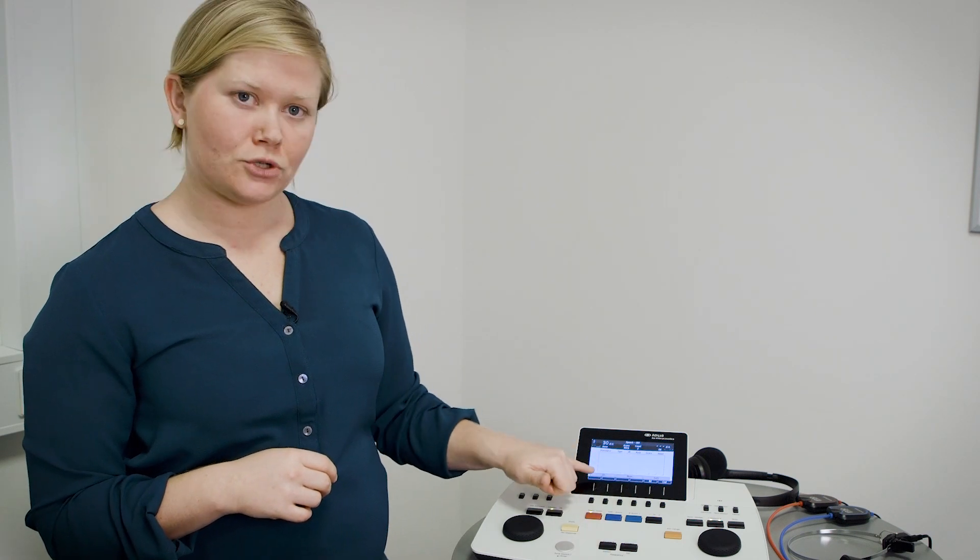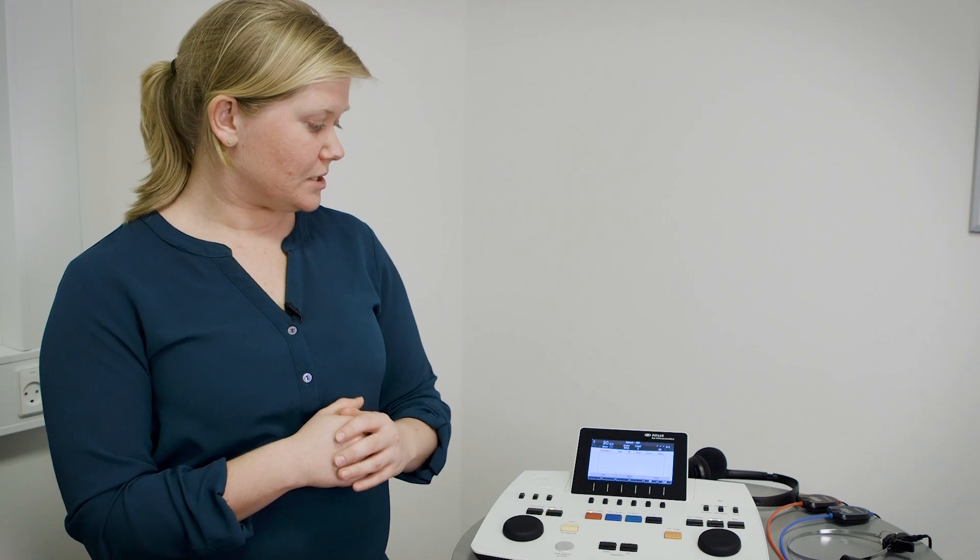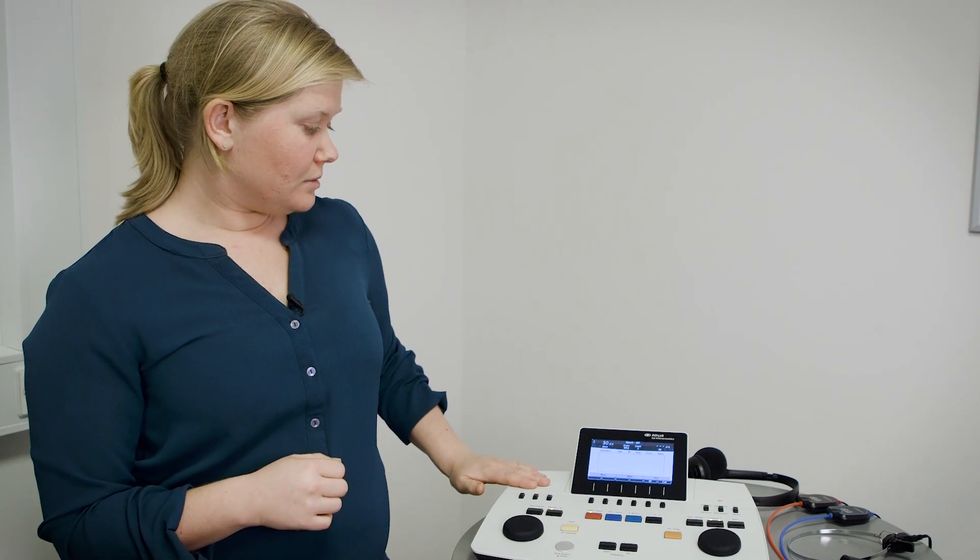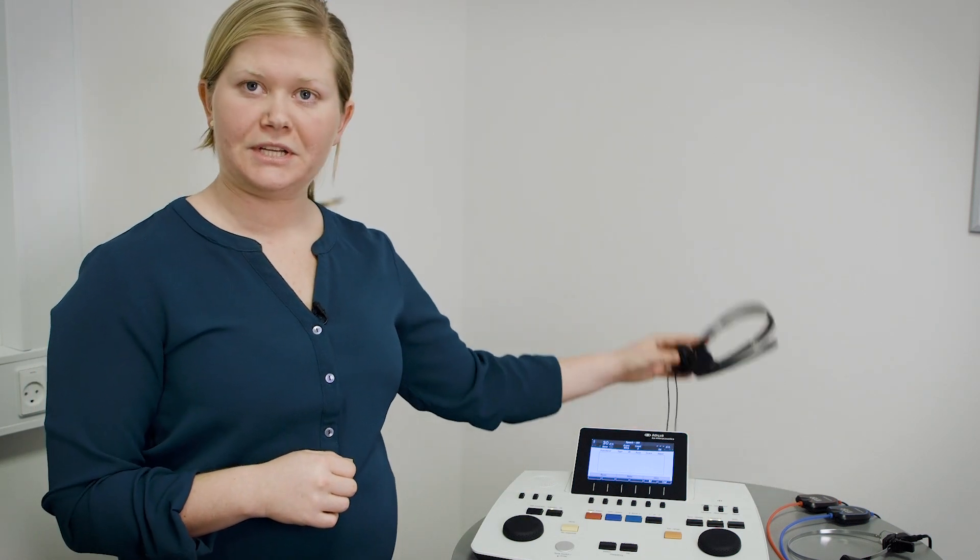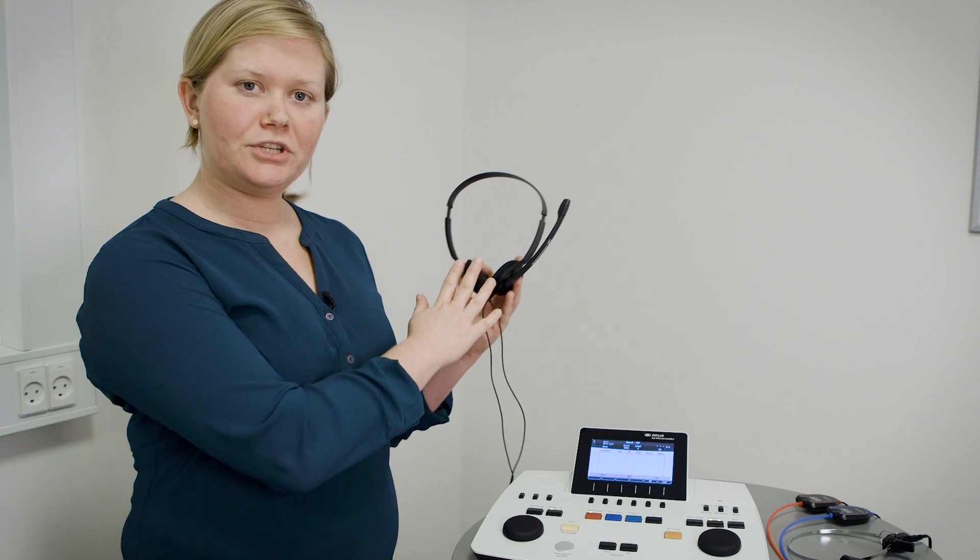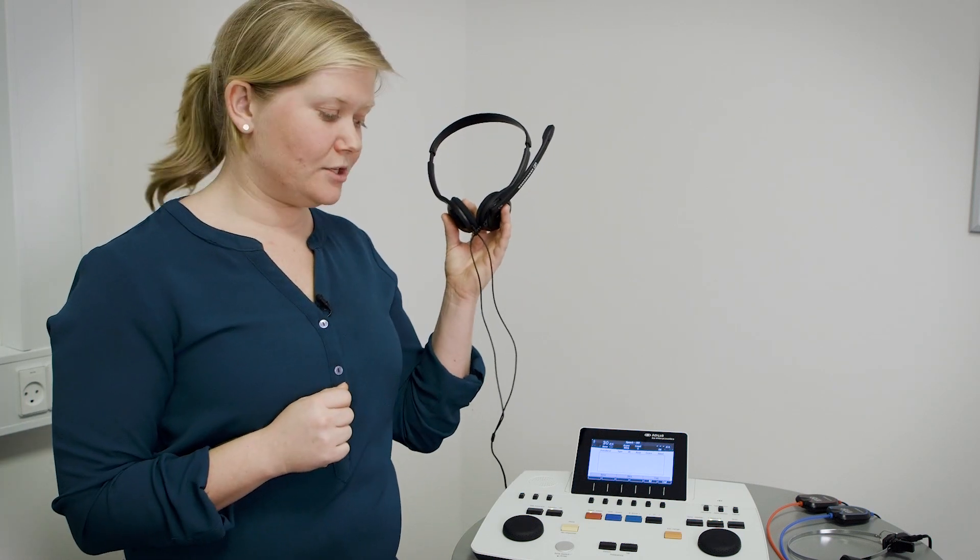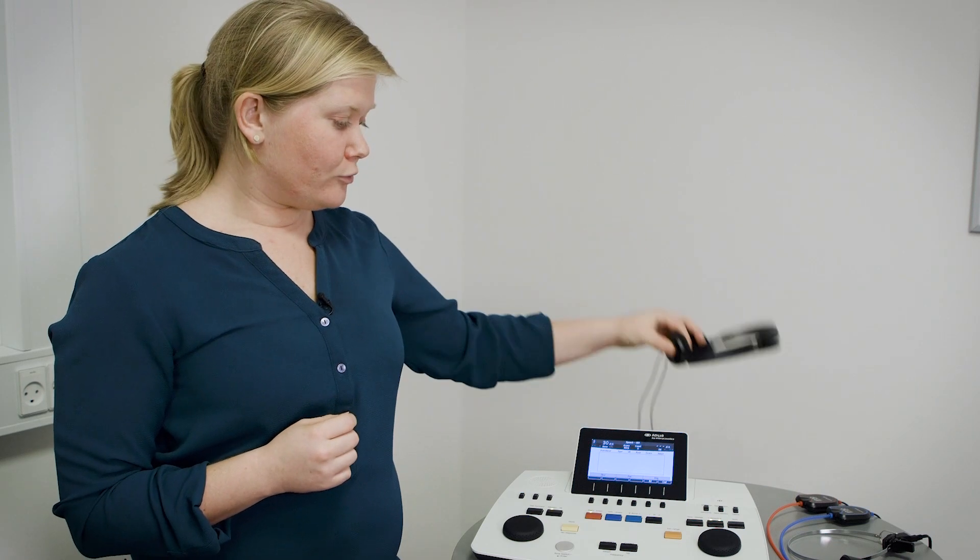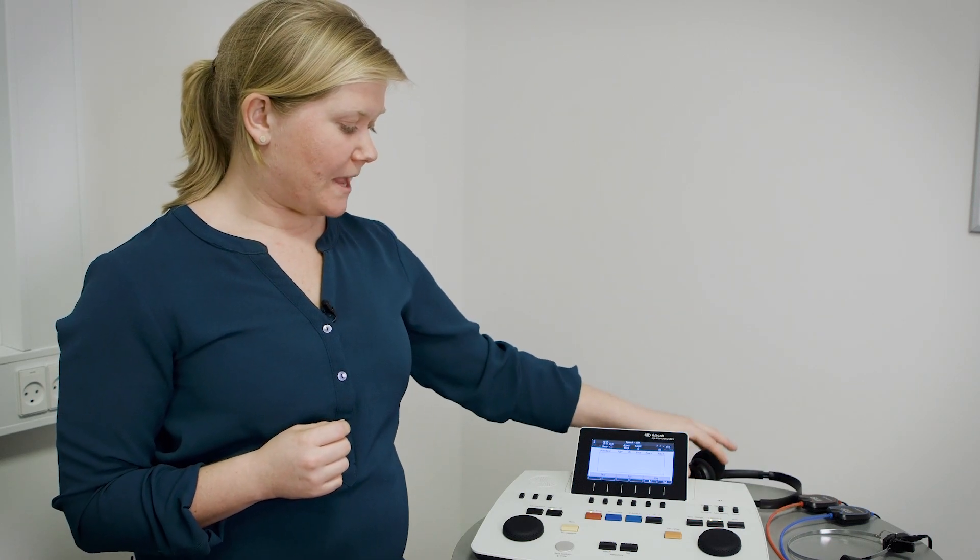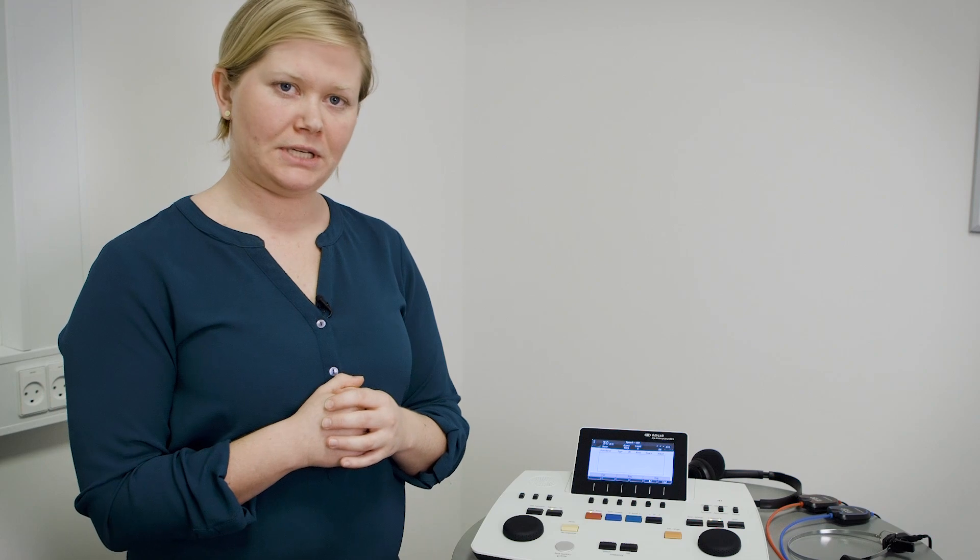We can see the words that are currently being presented to the patient, hear them on the speaker or on the monitor headset. Right now the monitor headset is connected so I can hear the tones and the speech being presented through the monitor headset and see if that is correct or incorrect.